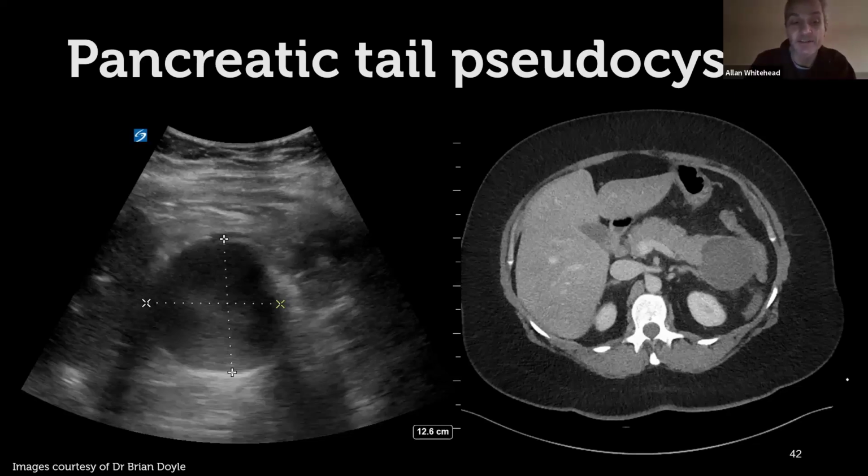The other thing in that area I was going to say is, most of the time if we find something in that area, it's much more commonly coming from the kidney, whether it's a large cyst or a mass. So my first instinct would be that it's probably coming from the kidney. But I suspect you looked really carefully around the kidney and established that it wasn't in contact with the kidney at any point. Correct. I could tell it wasn't part of the kidney. You see hundreds of these renal cysts, and they're anechoic and usually attached to the cortex. This was clearly separate from it, and I have a couple of video clips I saved that clearly demonstrate it.